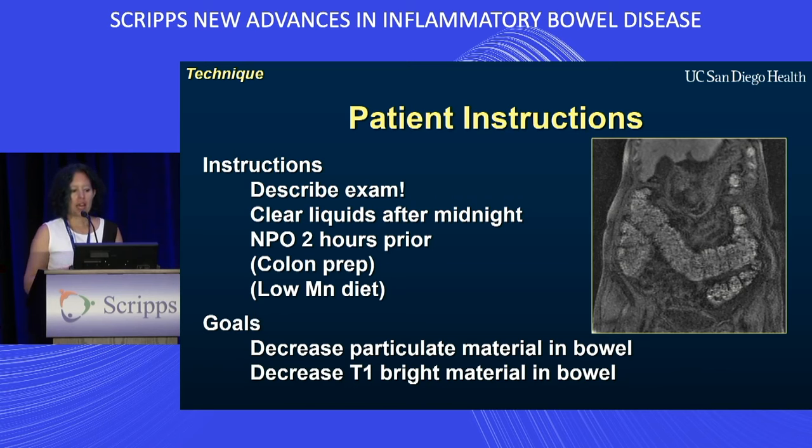The patients need to have clear liquids after midnight. They'll be NPO for about 2 hours prior to the examination. And a lot of this is in an effort to decrease the amount of particulate matter as well as things that can cause susceptibility artifact within the colon.